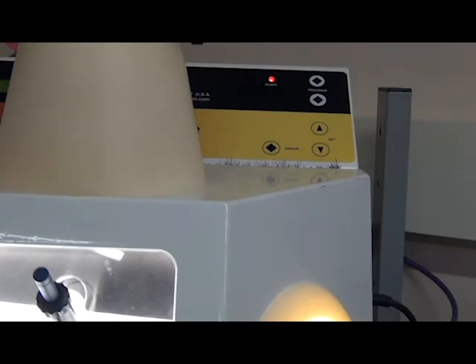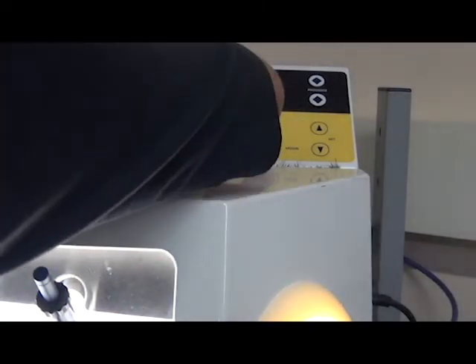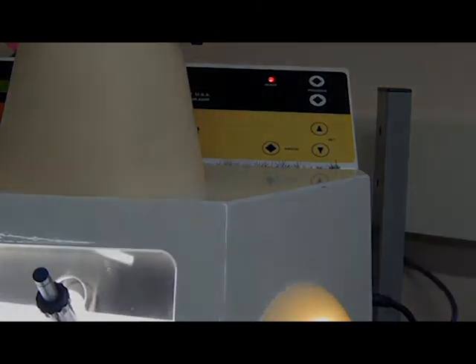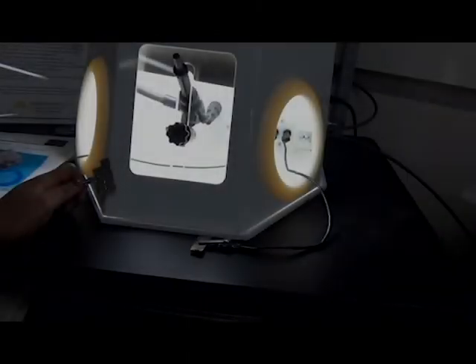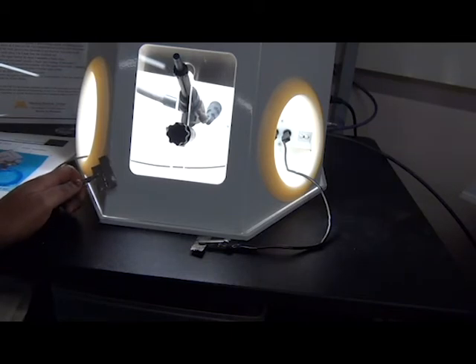Finally, when ready, press the argon gas button for three seconds. It is necessary to distance the electrode and the sample one millimeter apart.